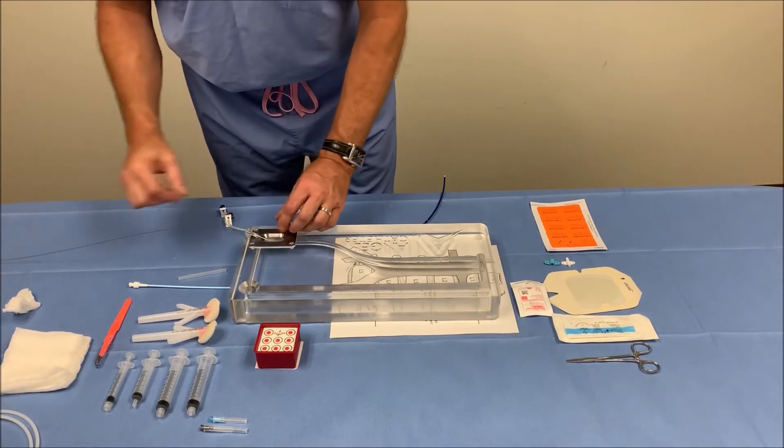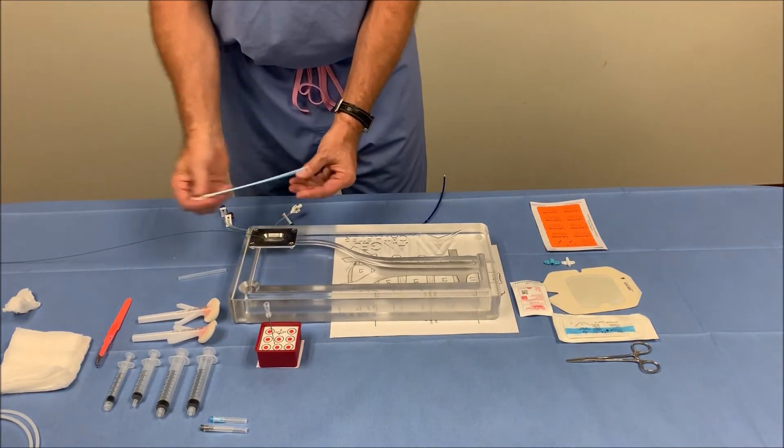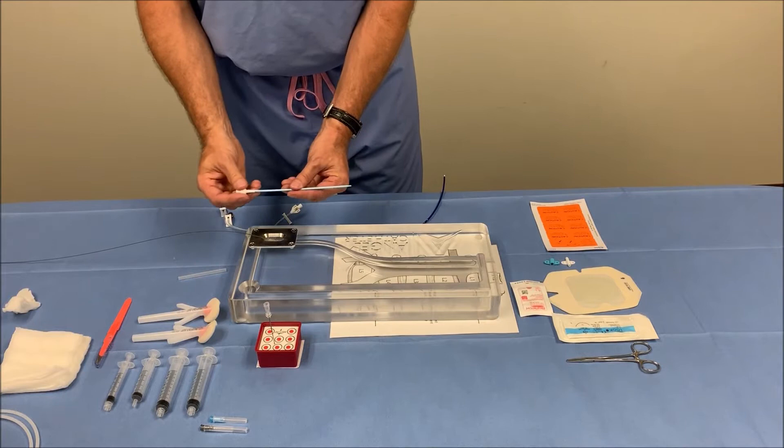It's good to place a little bit over half of the wire into the patient. Now we'll take our 9 French dilator and we will dilate the vascular anatomy.